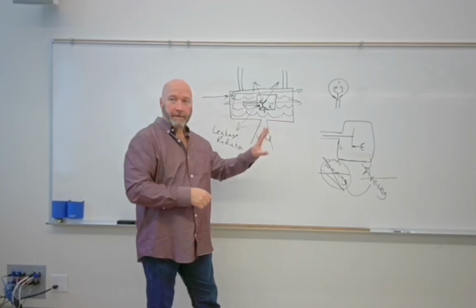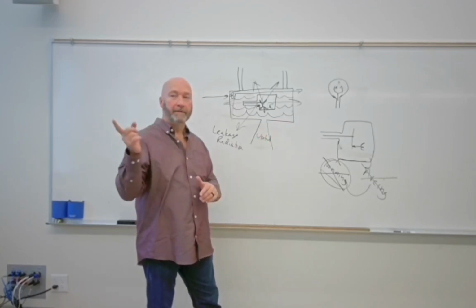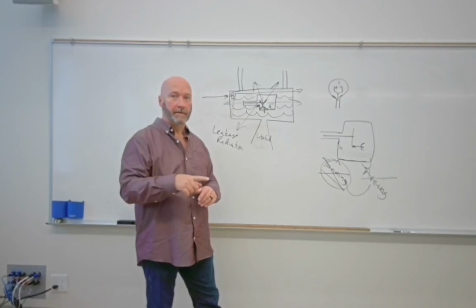Okay, everybody good with all this? Benefit to a metal tube is no arcing, right?